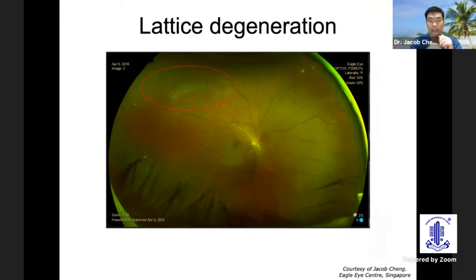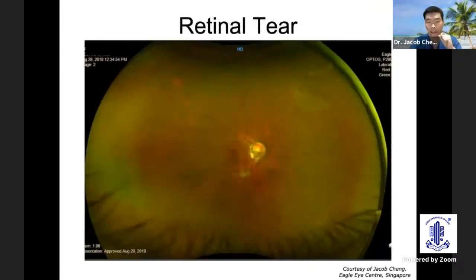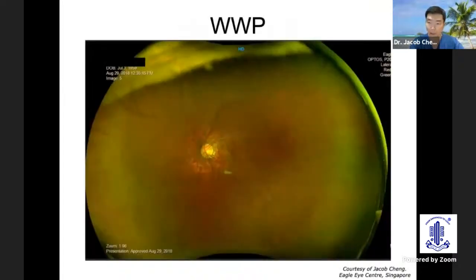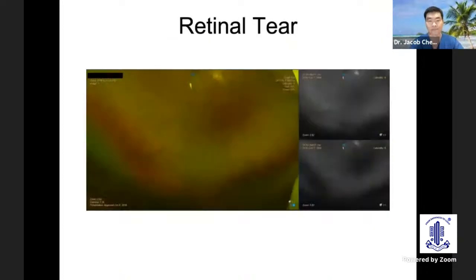Here you can see the lattice degeneration. Here again, documentation of the retinal tear, again with 360 degrees burn around the tear to secure that the tear has been nicely secured with laser. Again, on the opposite eye, to document the white without pressure that this patient has.